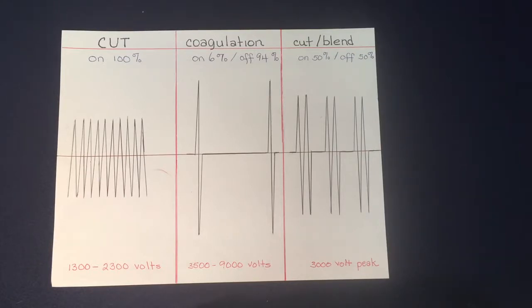Now you have the coagulation, and the coagulation is about three times what the cut is, of course depending on what settings a surgeon has it set to. But the coagulation is going to go from 3500 to 9000 volts and it's going to be on only about 6% of the time. 94% of the time it's going to be off.